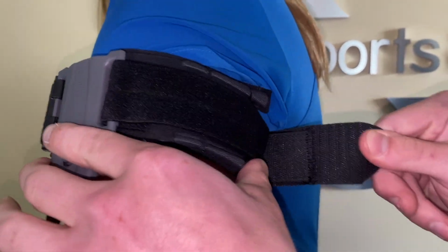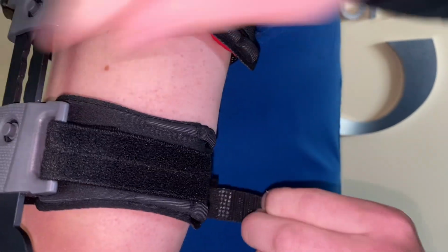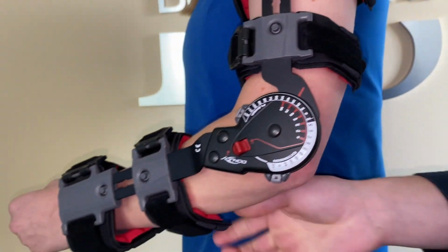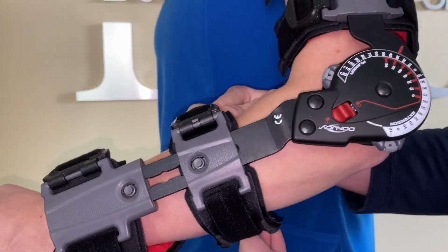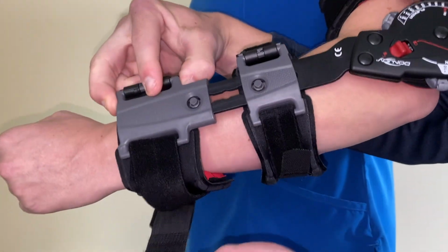There is an alligator Velcro tag attached to each quick clip. Once you are clipped into the brace, you may tighten each strap using the alligator quick clip tag. This Velcro tag can be cut and adjusted if necessary. You may find yourself adjusting the tightness of your brace frequently, as the brace can slip down as your muscles begin to atrophy and the swelling begins to go down.